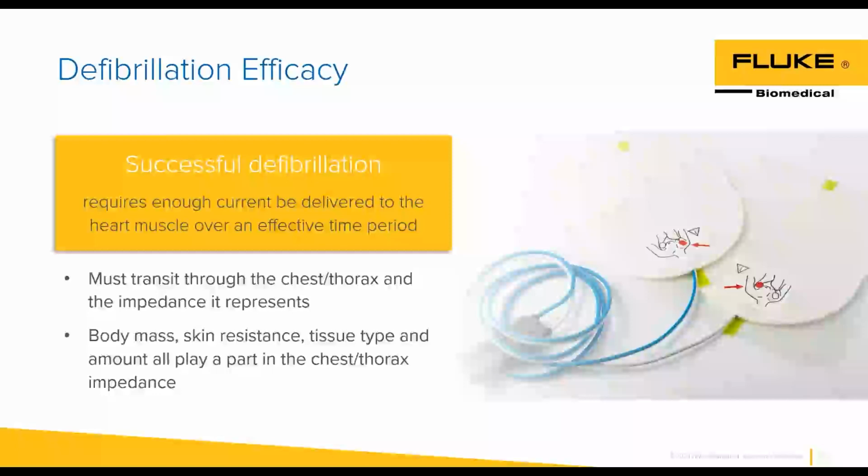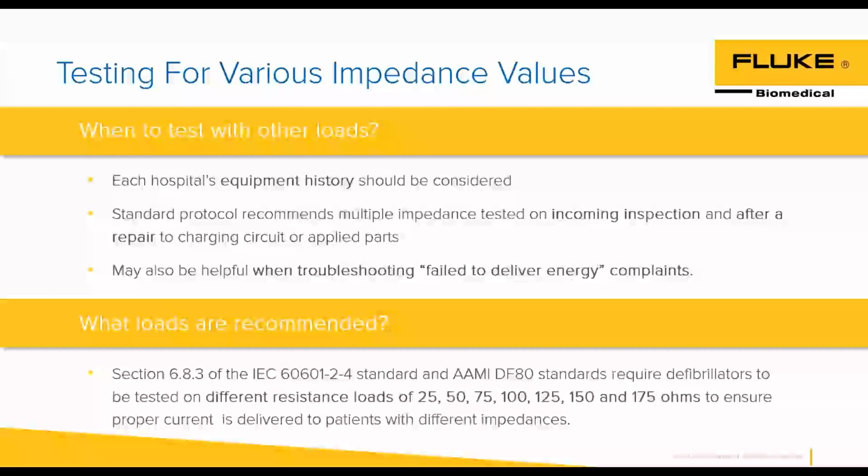So let's move to the next one. We're going to talk about testing for various impedance values. So we want to consider what's the history of the equipment. When was it built? How is it designed? What's it supposed to be doing? Really look at how that defibrillator is supposed to be performing its job. Is there a protocol in place stating that you should be doing this?